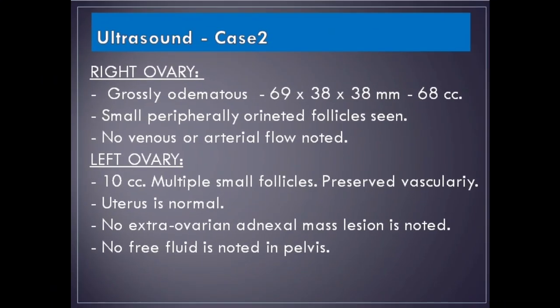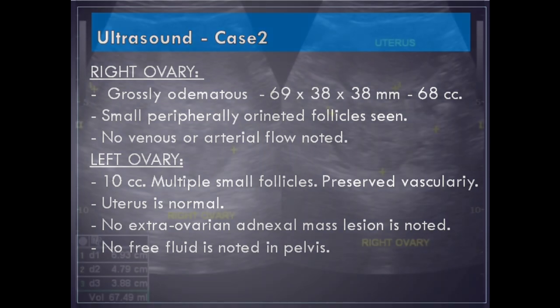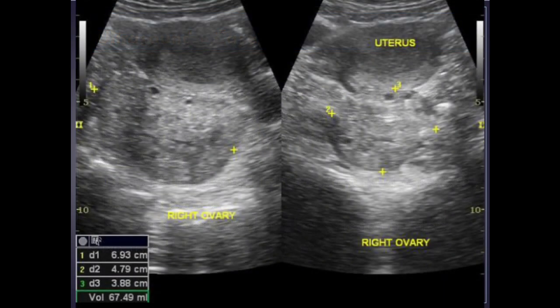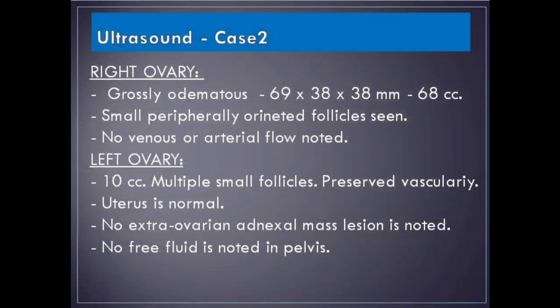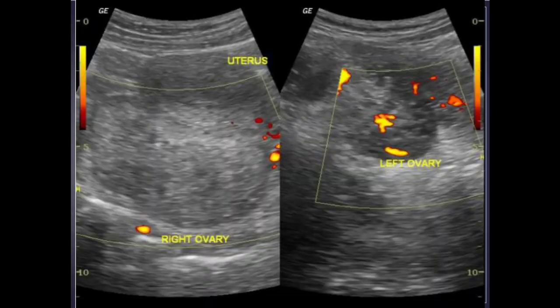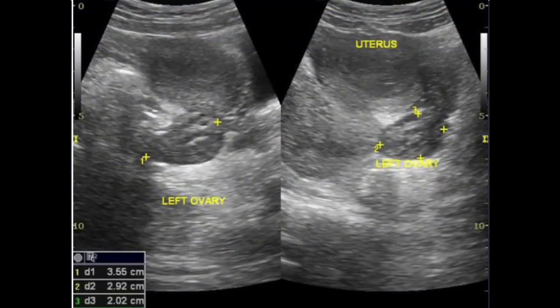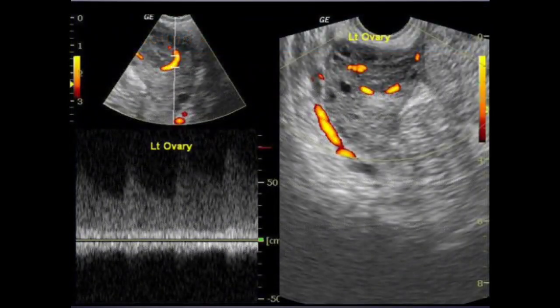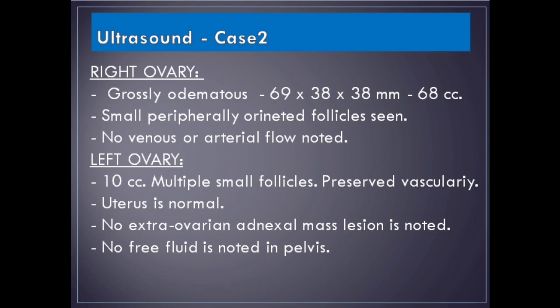Case 2: A 20-year-old female presented with right lower abdominal pain and vomiting starting 5 days prior. The right ovary is grossly edematous measuring 69 x 38 x 38 mm (68 cc) with small peripherally oriented follicles seen and no venous or arterial flow noted. The left ovary is 10 cc with multiple small follicles and preserved vascularity. The uterus is normal. No extra-ovarian adnexal mass and no free fluid in the pelvis.